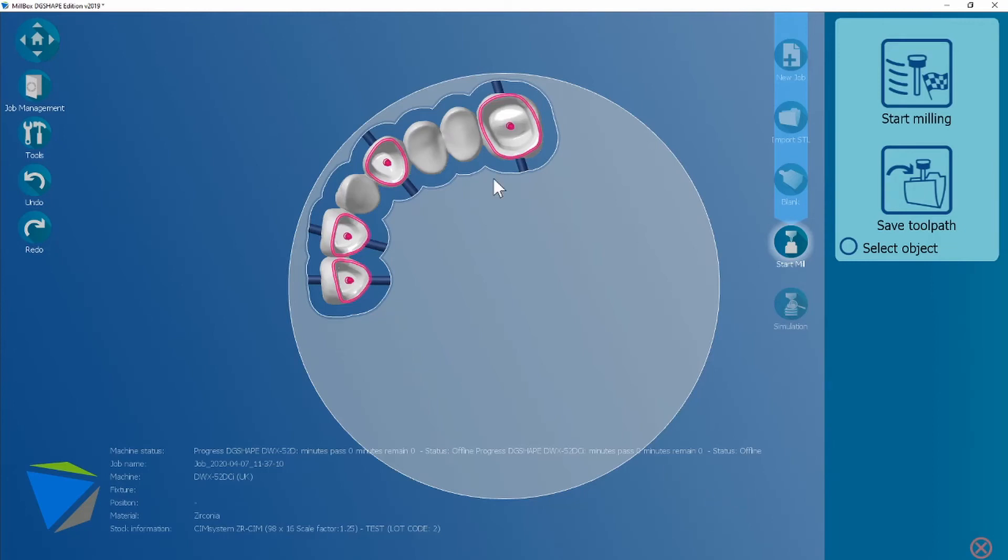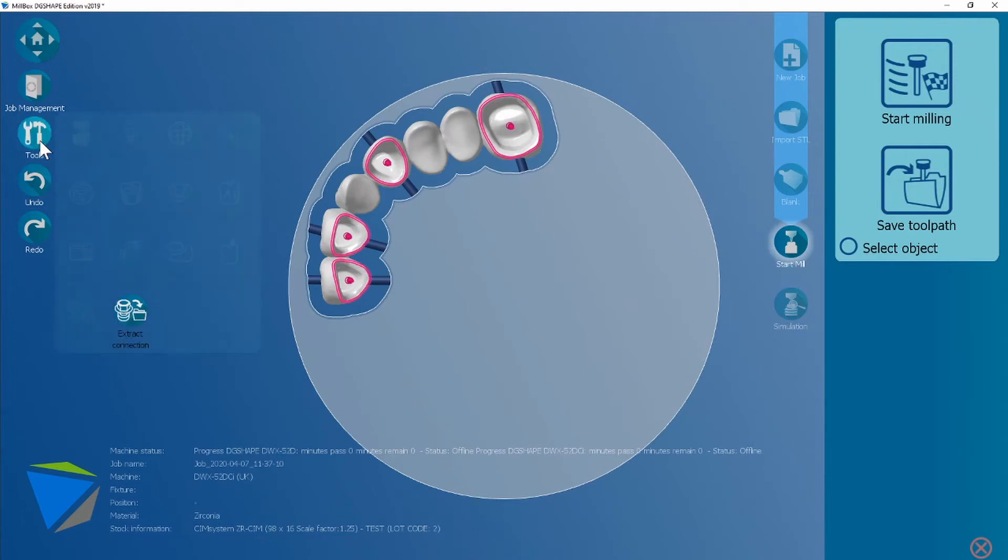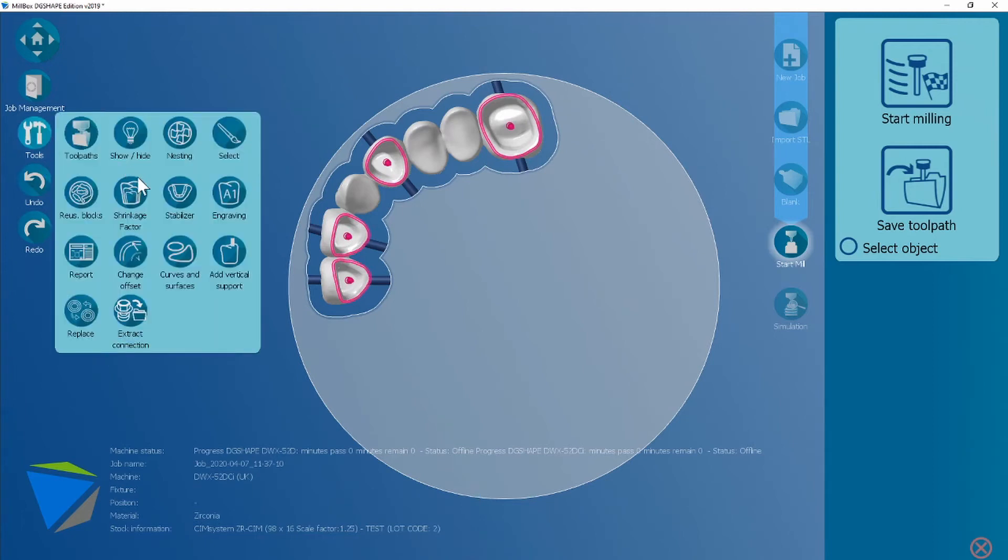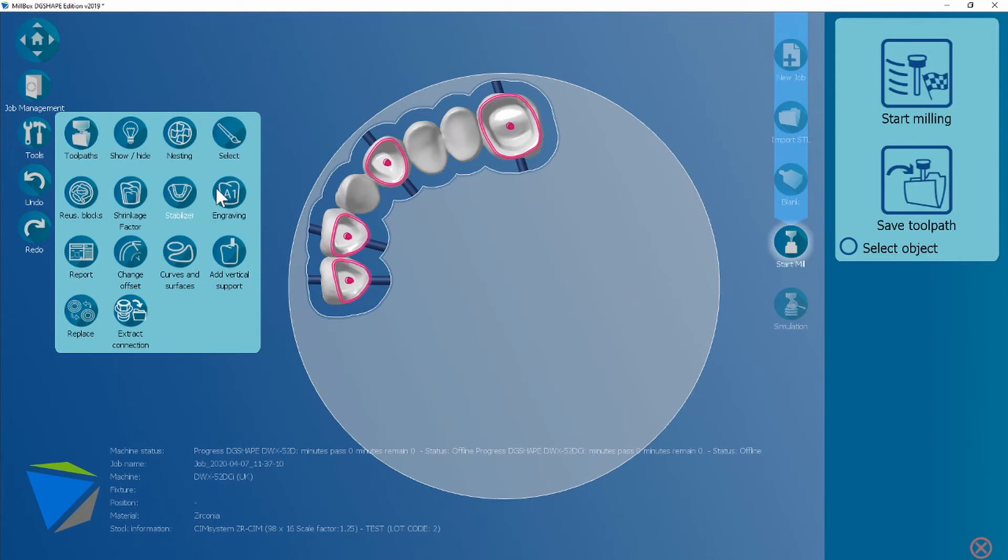So sometimes you'll want to add a stabilizer for large span bridges with a large curve to them. They do have a tendency to, like metal, warp in the furnace so we're going to add a stabilizer. In tools, then you click stabilizer and you'll get a number of options that you can choose from.